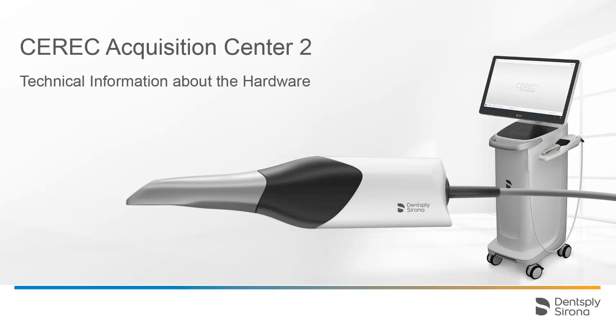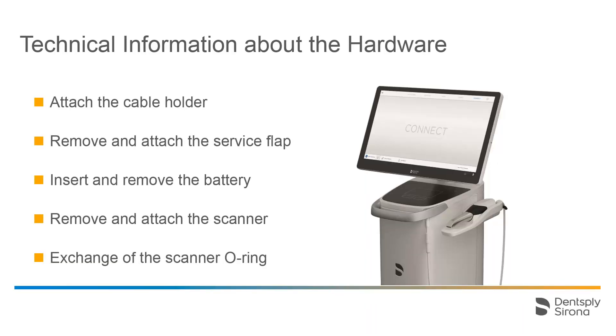Welcome to this video tutorial on the topic of the CEREC Acquisition Center 2. In this video, you will receive technical information about the hardware. With the help of short video sequences, we will demonstrate the following procedures: attaching the cable holder, removal and reattachment of the service cover, insertion and removal of the battery, as well as removing and reattaching the scanner and exchanging the O-ring.